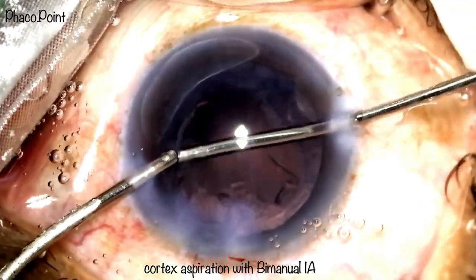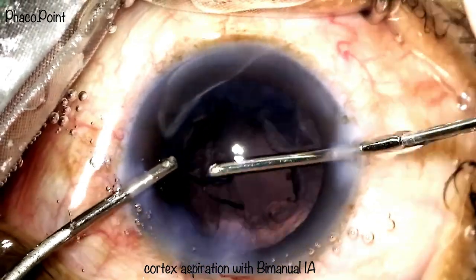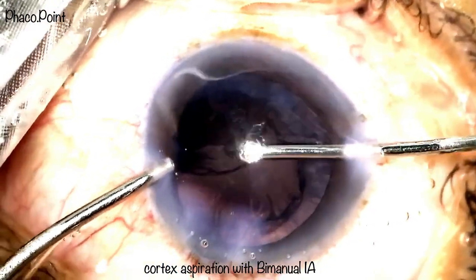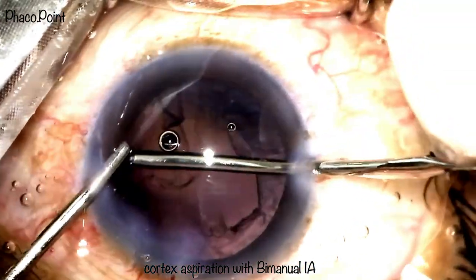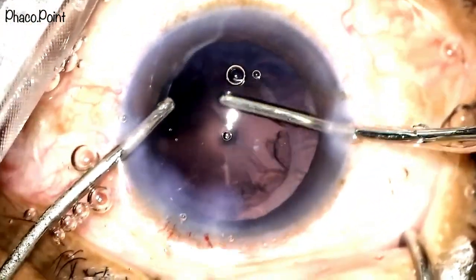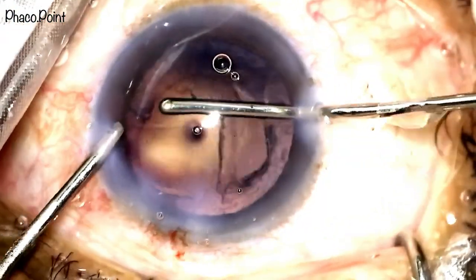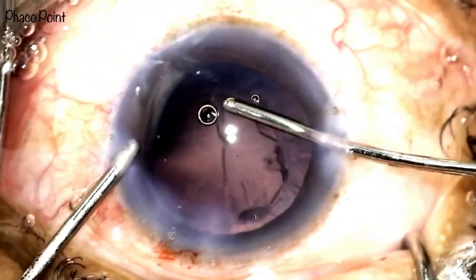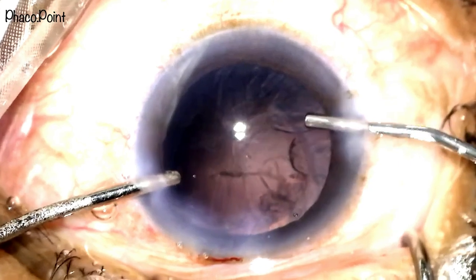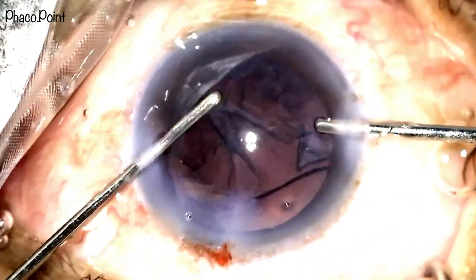Removal of cortex can be challenging in a patient with zonular dialysis who has had a CTR implanted, because cortex can get trapped between the CTR and the equator of the bag. On attempting to remove the trapped inferior cortex, you can see it pulls on the CTR and tends to draw it inward. The solution is to hold the cortex, draw it toward the open loop of the CTR, and then aspirate it. The rest of the cortical aspiration then proceeds.